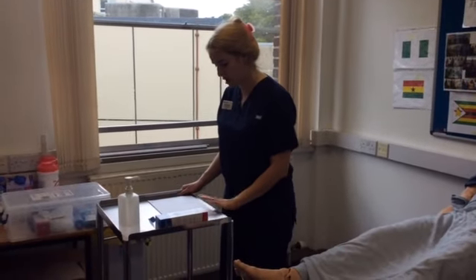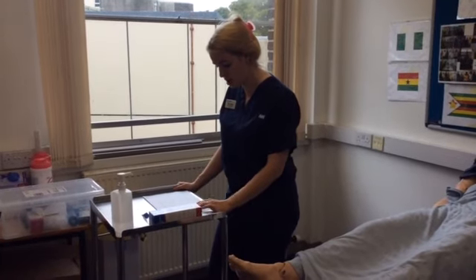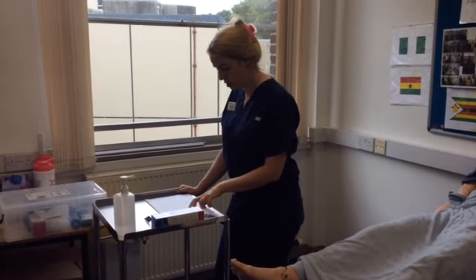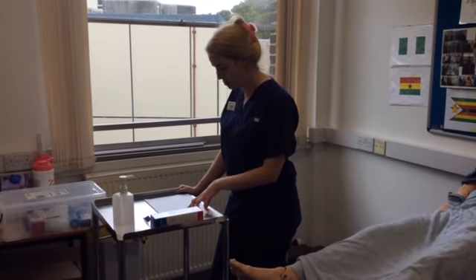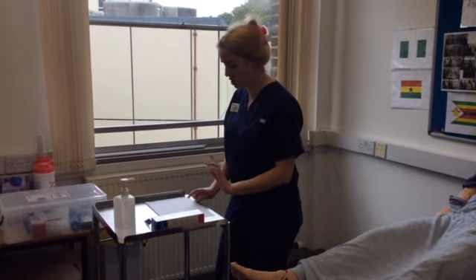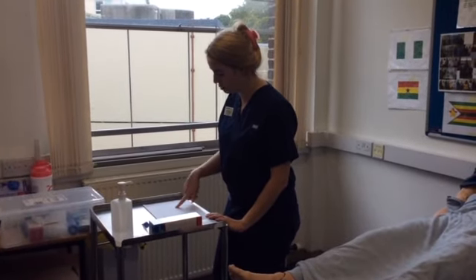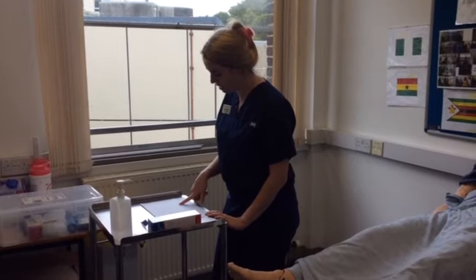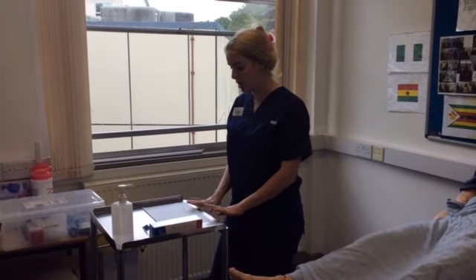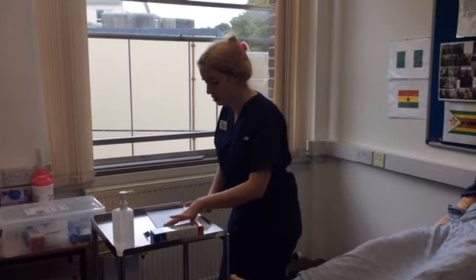Before I do that, I'm going to check my drug chart. So here I can see the patient's details are correct. I've checked that with him. Allergies are completed, paracetamol. The drug I'm due to administer is salbutamol. And the dose is 200 micrograms, which I know is 2 puffs, but I will check that against my medication in a minute. And the time due is 12 o'clock, and it's 12 o'clock now, and it has been signed by Dr. Jones, so I'm happy to proceed with this prescription. If I was unsure about anything, I would go and liaise with the doctor who prescribed it.